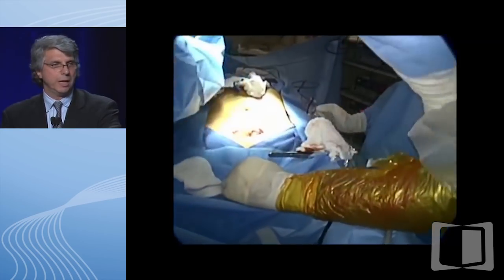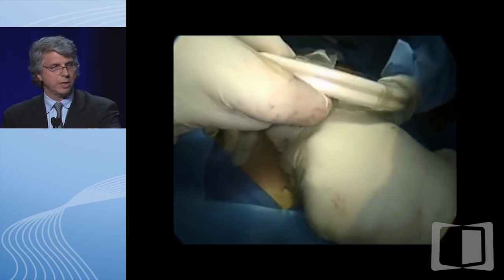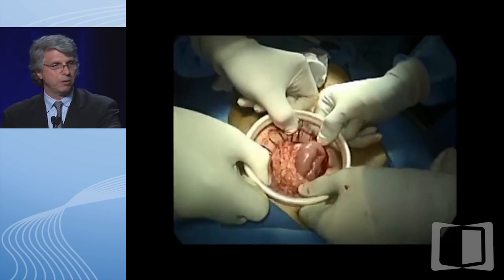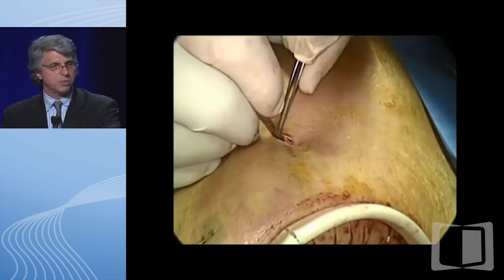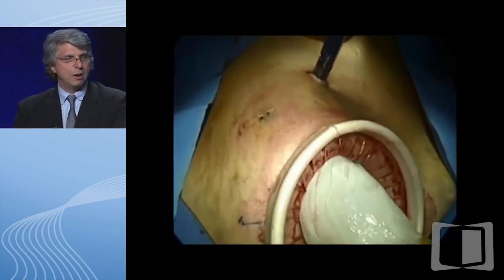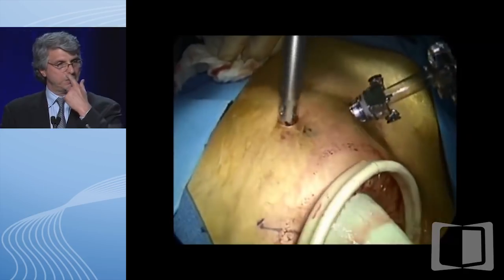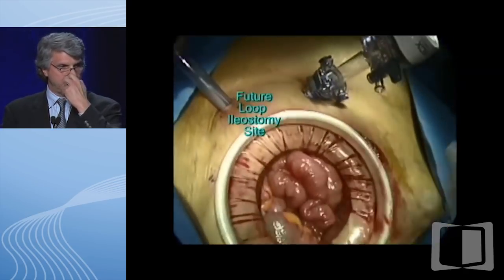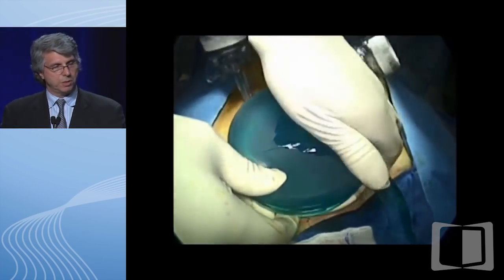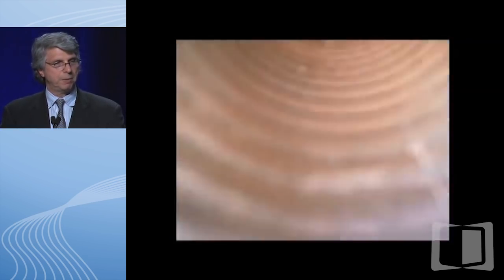This is the hand-assisted ileal pouch-anal anastomosis. Studies have shown that you get the same advantage over hand-assist as you do over total laparoscopic surgery. The other advantage of putting this particular instrument in is it actually reduces wound infection rates. A trocar is now being placed in the umbilicus. You can see another trocar being placed in the right lower quadrant—that becomes the future ileostomy site. We take advantage of the fact that we have to make a hole for the ileostomy and therefore use a trocar through it.